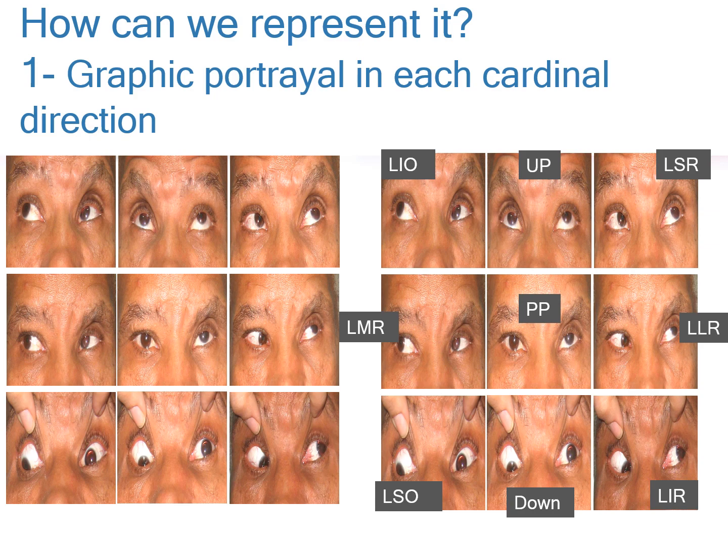This way, one can tell that the greatest deviation is in the field of action of the left inferior rectus muscle, with the greatest amount of hypertropia, indicating a problem in this gaze direction and in this muscle.